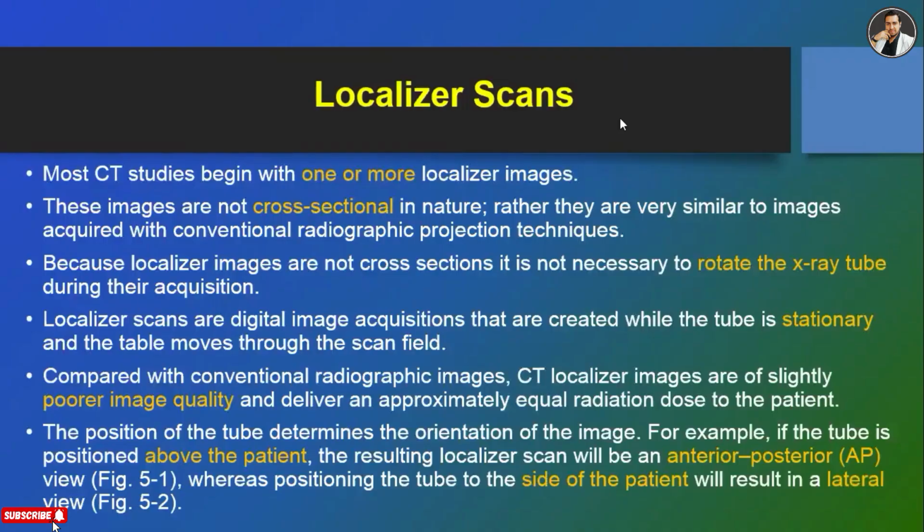The next is the localizer scan. The first area is the localizer or topogram.